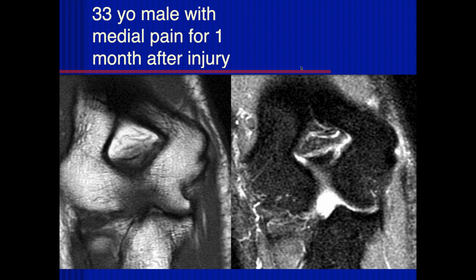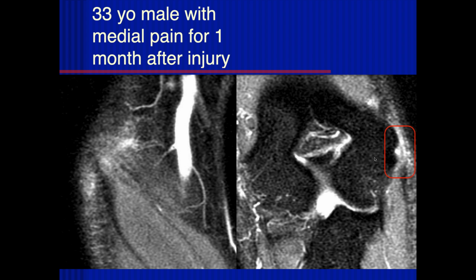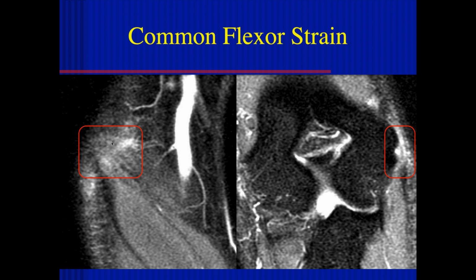So here's a 33-year-old male with medial pain 1 month after an injury, and we can see that there's a little bit of signal here, but on the PD fat-sat, we can see increased signal intensity within the common flexor tendon origin from the medial epicondyle, right in that location. And here we could see that area here. Here's the medial muscle, the flexor muscle mass coming in here. So this was an acute strain of the common flexor tendon. And it's not torn and displaced at the current time, but strained.